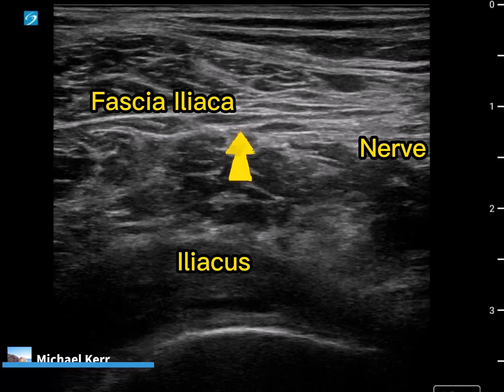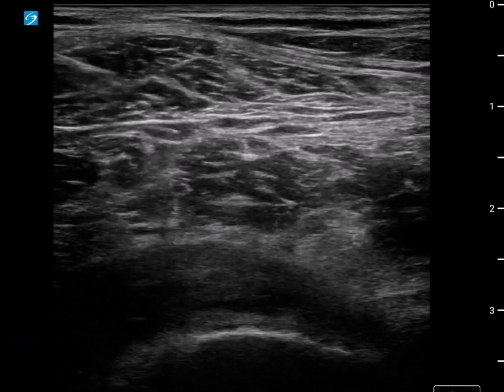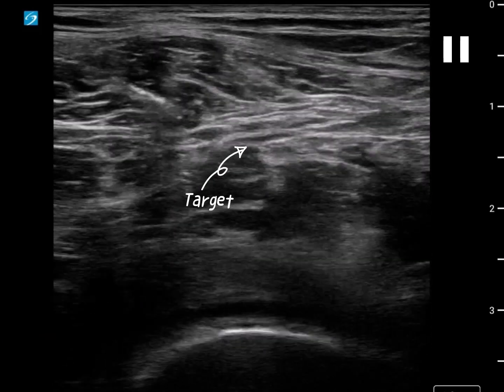As we play the video, we're going to pause here. We've identified where our needle trajectory is and where our target is. We think that this is nerve here, and it certainly looks like nerve, and we think that this is a reasonably safe distance away - that it's a good approach.